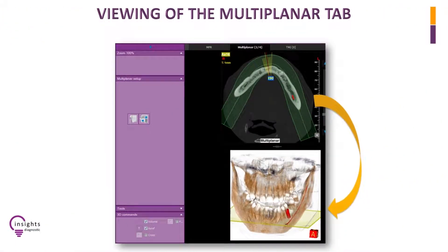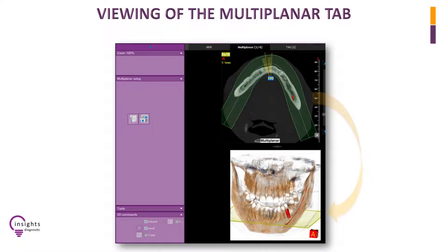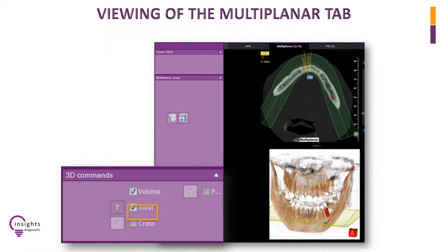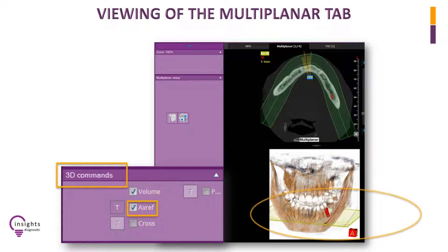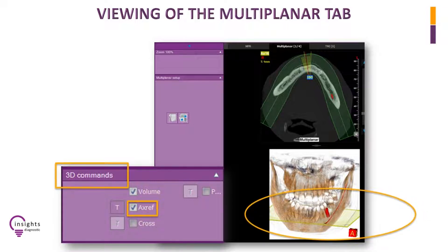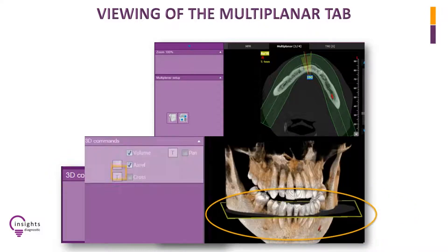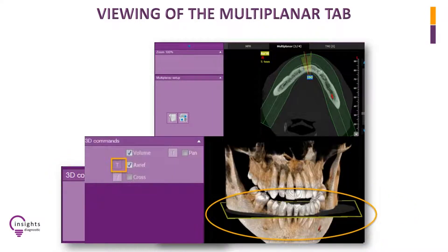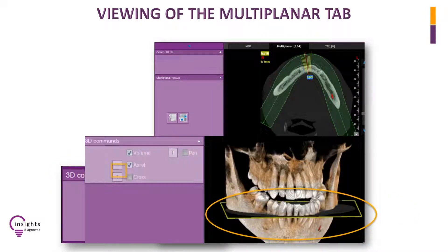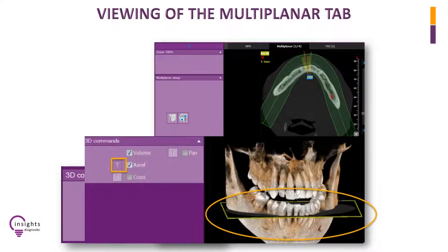The 3D model provides reference on the different views in the Multiplanar window. Try clicking on AxRef at the lower left corner of the toolbars under 3D commands to see the yellow planar reference through the 3D model. Click on letter T at the adjacent left of AxRef to make the plane transparent.